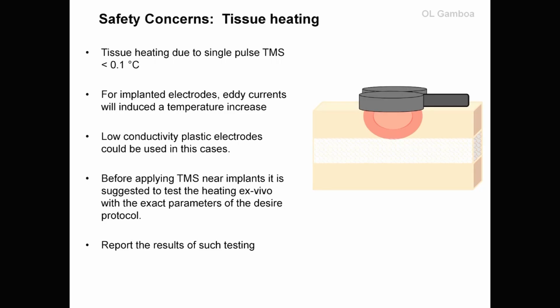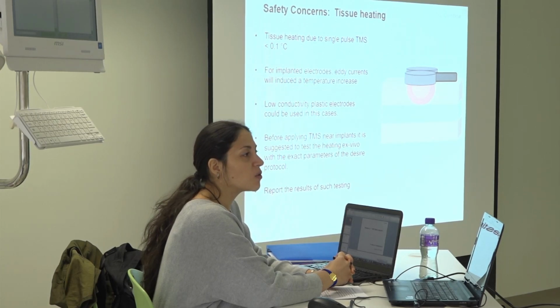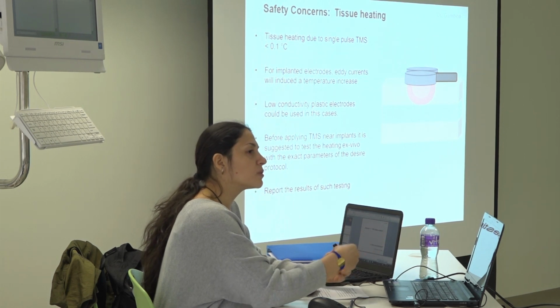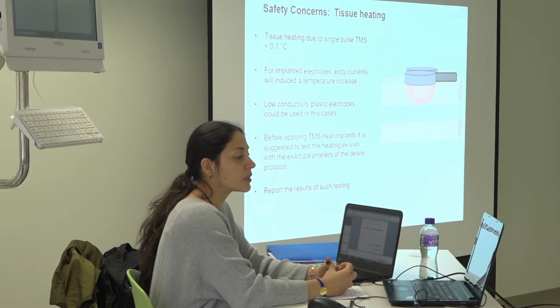So, safety concern about tissue heating. Tissue heating due to single pulse TMS will not happen, because it will be less than 0.1 degrees Celsius. So it's actually not really hot; a single pulse is really harmless. But the problem is when you have implanted electrodes. If you have electrodes that are implanted, TMS can cause some temperature increase.